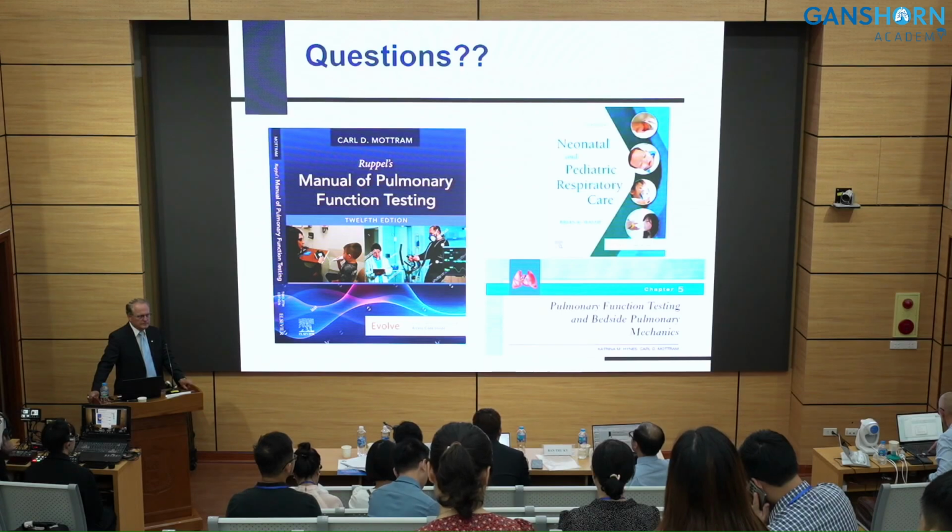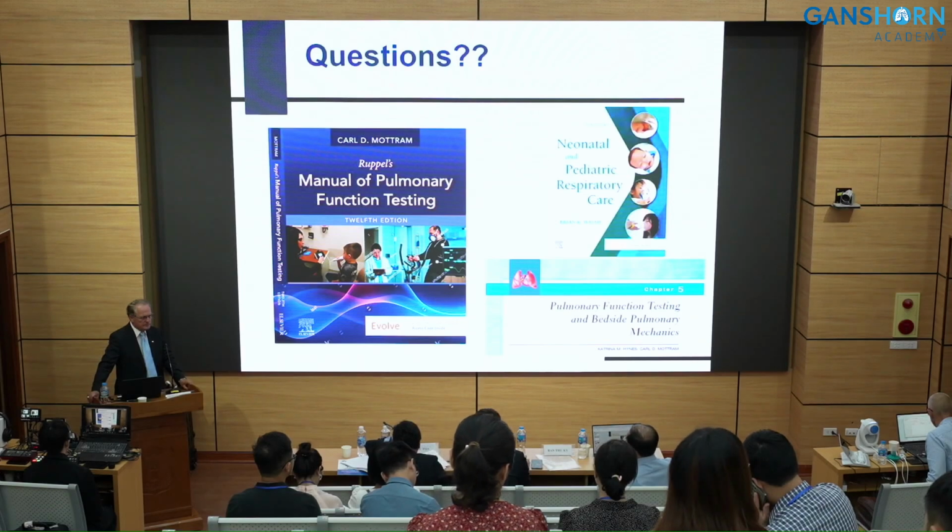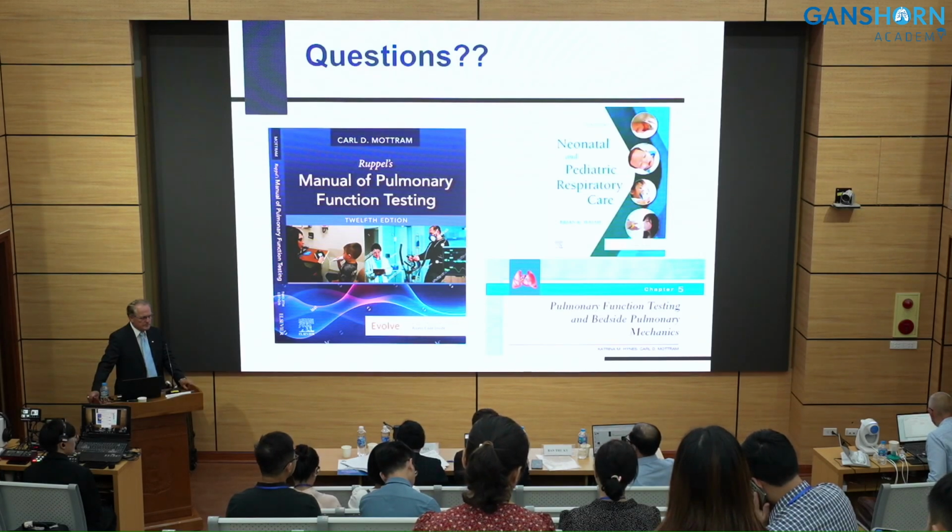Đó là phần khi chúng ta phân tích kết quả, mình dựa trên kết quả để xem IOS có đáp ứng với test giãn phế quản hay không, hoặc có tăng kháng trở của đường dẫn khí khi đo cho người được đo hay không, cũng như phân tích kết quả đo dao động hô hấp. Đó là phần bài của giáo sư Cạc.